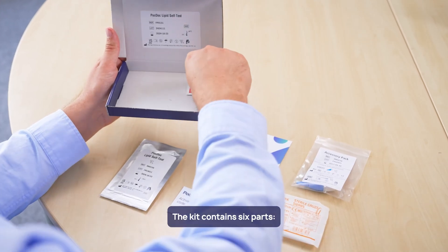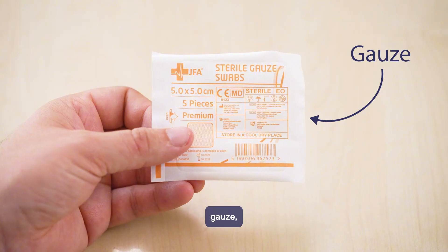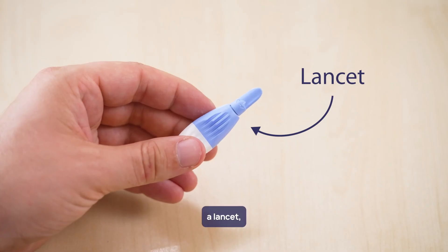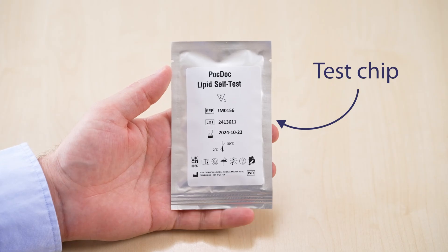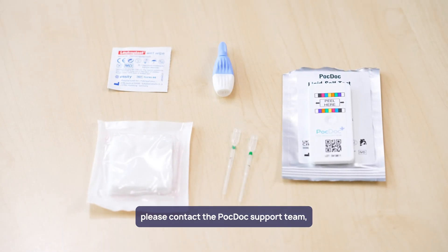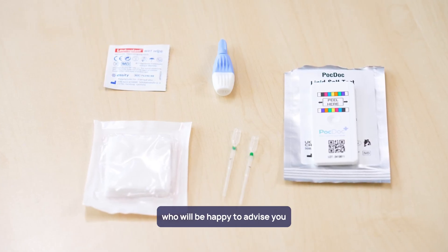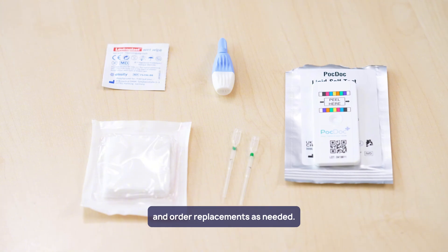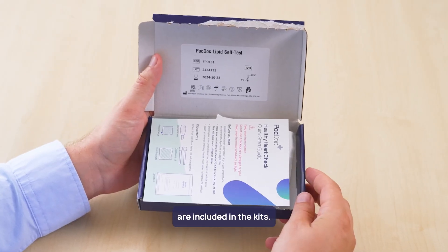The kit contains six parts: an alcohol wipe, gauze, a lancet, two pipettes, and the test chip. If any of the parts are missing or damaged, please contact the PocDoc support team who will be happy to advise you and order replacements as needed. Details of how to reach the support team are included in the kit.